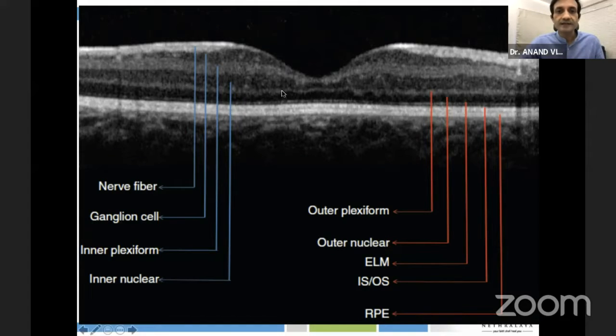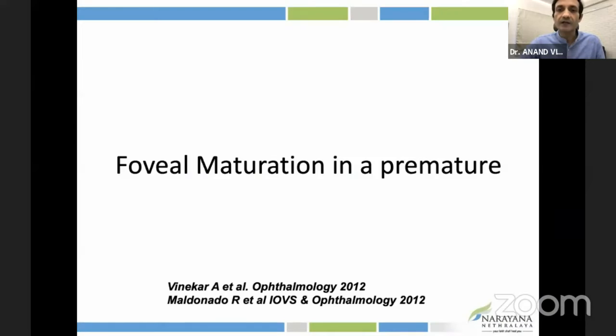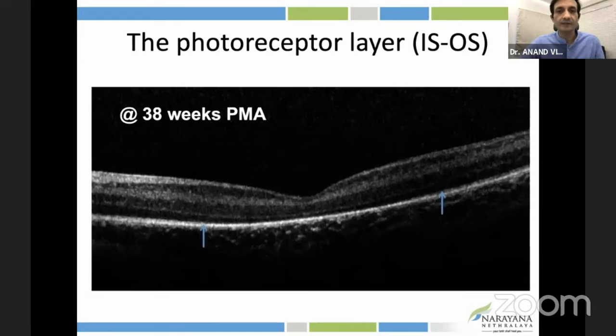So firstly, this outer plexiform layer, which is moving straight here, there is a gap between that and the inner limiting membrane. So there are inner retinal layers that have not disappeared. The other changes, we'll see them as we go on, is the ellipsoid zone, or what used to be called the ISOS, or the photoreceptor layer, is either depleted or is present but is attenuated.